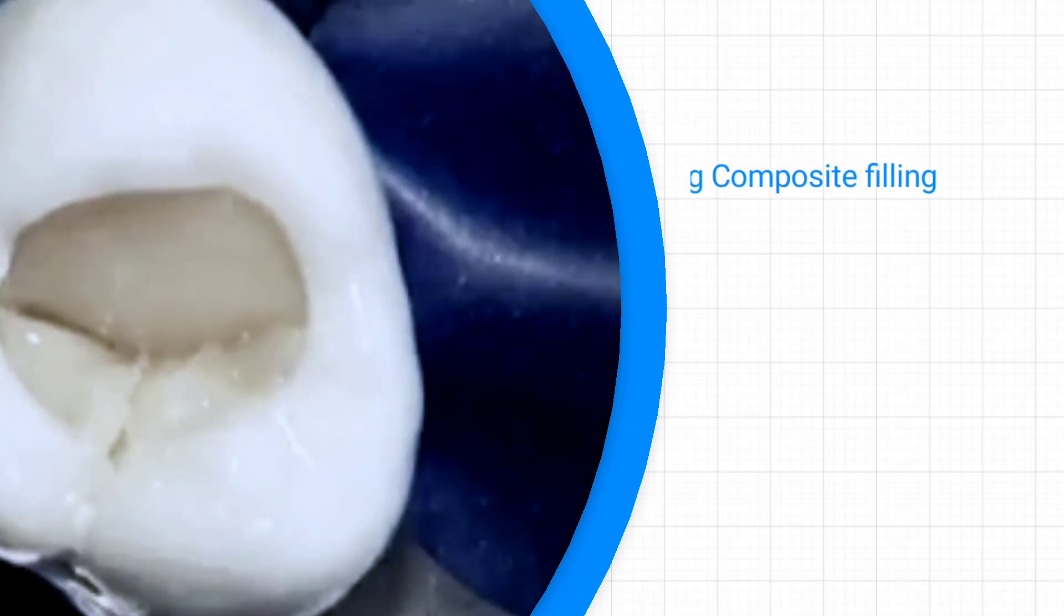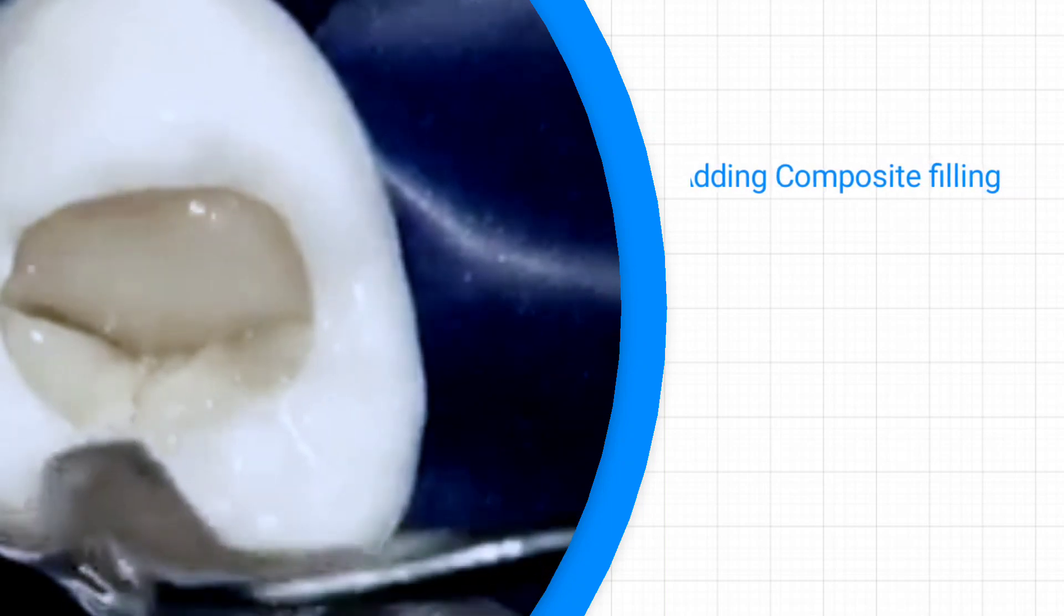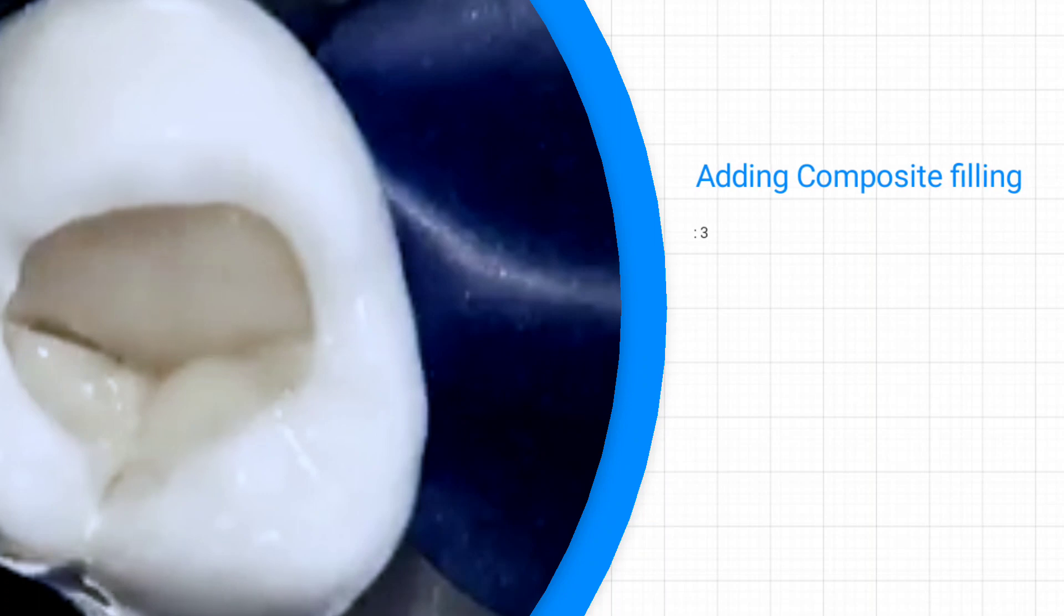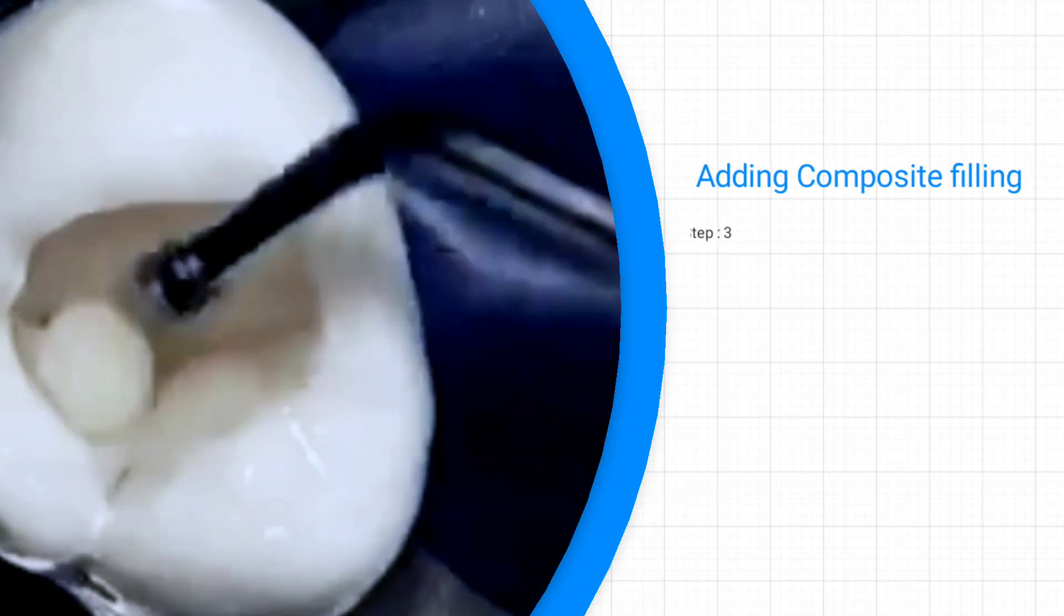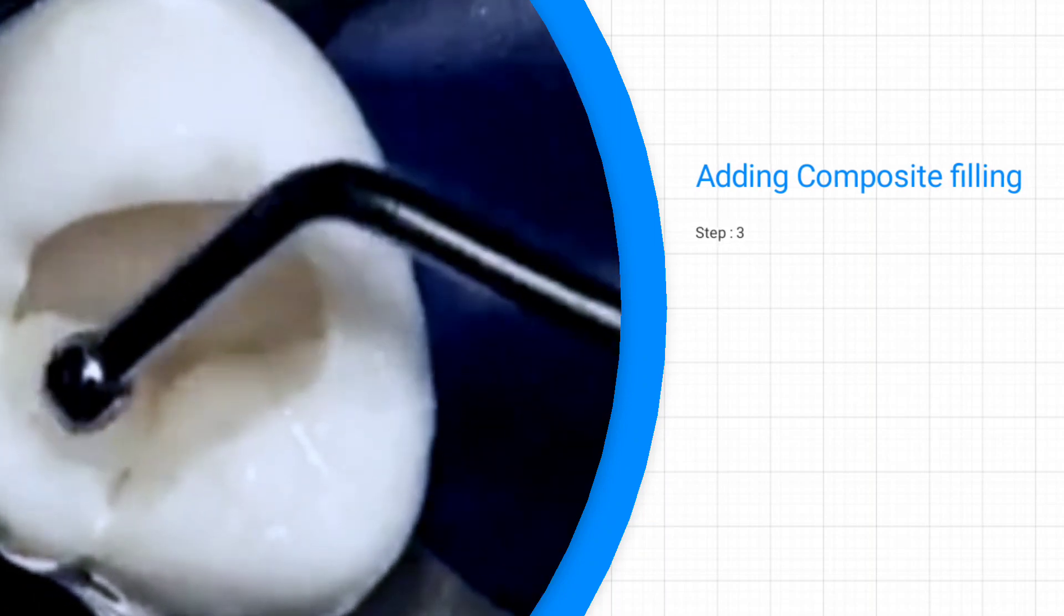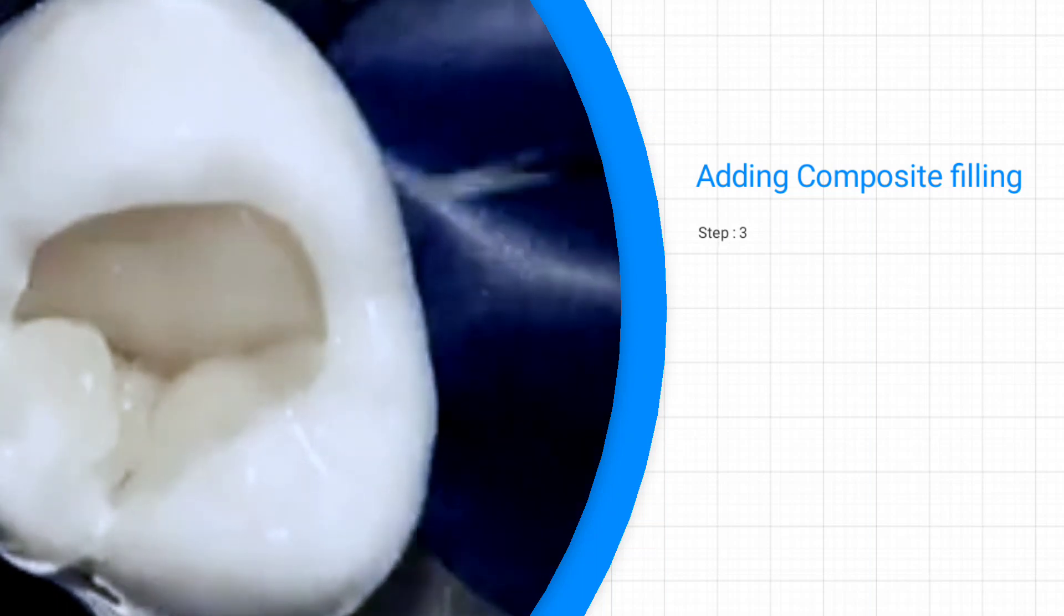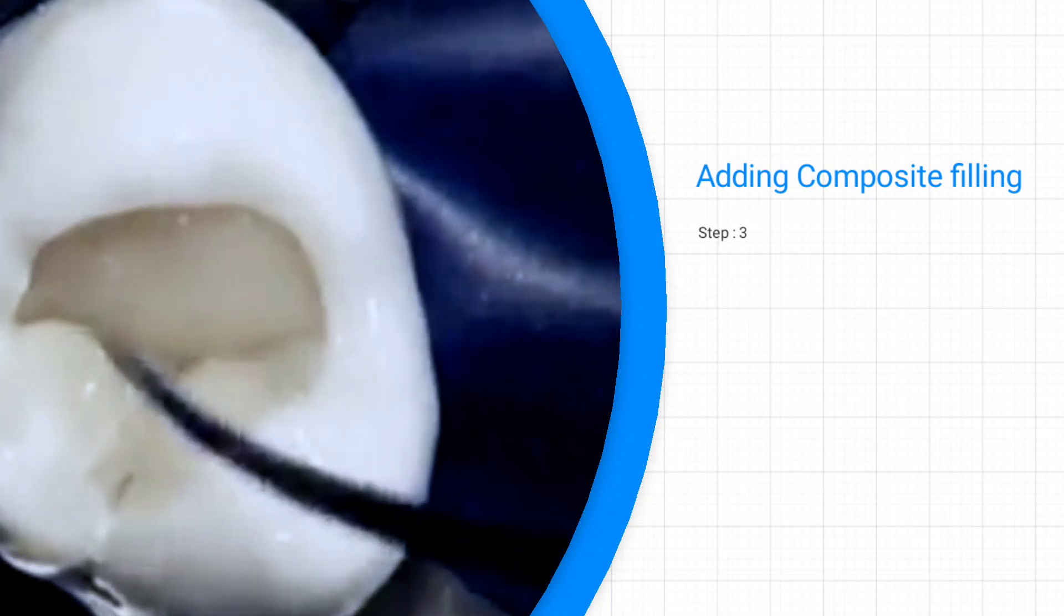Another reason has to do with the fact that the composite sets on a microscopic level—it shrinks, and this shrinkage is known as polymerization shrinkage. Keeping each layer thin helps us to keep the cumulative effect of this distortion to a minimum level. So instead of using a single lump, place and cure in addition of layers.